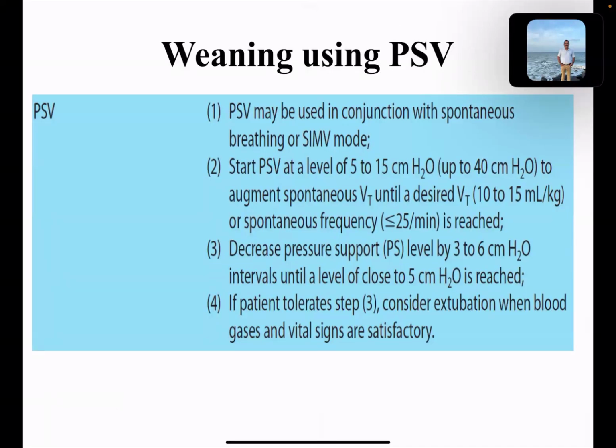So first I told the patient's T-piece trial. For the spontaneous breathing trial, you can give a T-piece. Another one is PSV, or pressure support ventilation. Basically, this is a CPAP method. CPAP means continuous positive airway pressure. It means throughout inspiration and expiration, a certain amount of pressure is given for the respiration. So that will be maintained through inspiration and expiration.